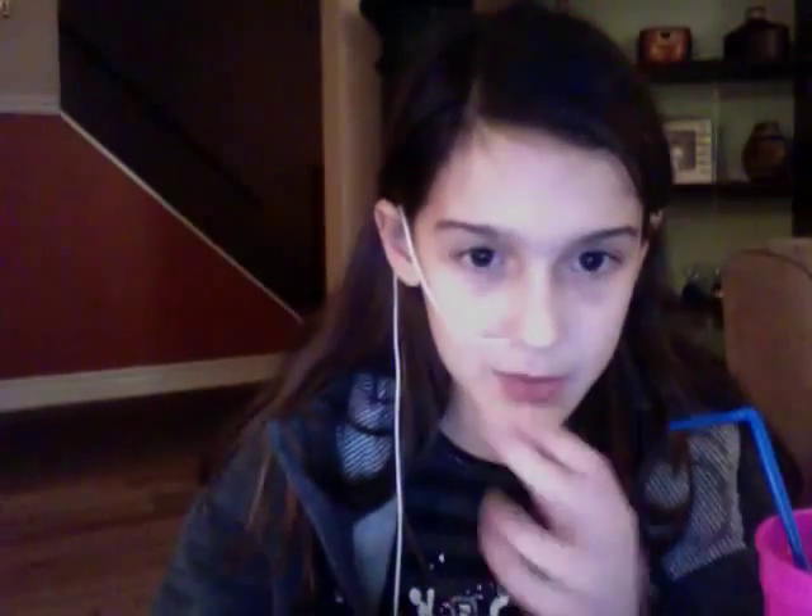It's always best to do this in a mirror — I'm using my computer camera. Make sure the sharpie mark is right there just under the nose. Then with the tape, just stick it there. Make sure you have the right kind of tape — this is tape especially meant for nasogastric feeding tubes. It's a bit long so I'll cut the corners. You can cut it into any shape you want — at the hospital they made me a heart.